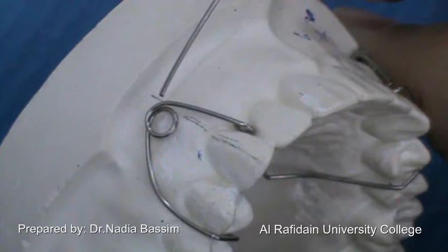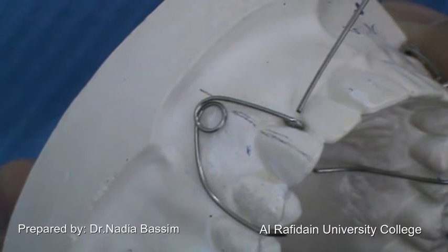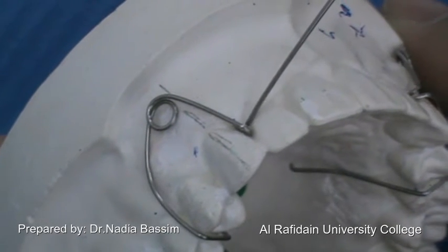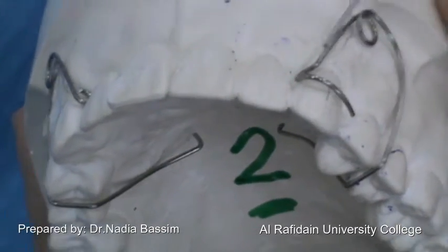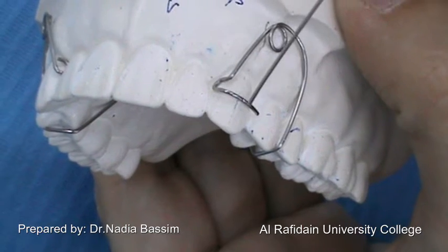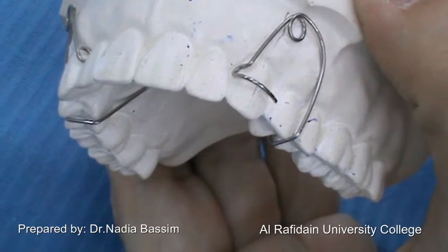We also have the mesial arc, which extends in a straight shape from the main coil into the interdental area. In the simple buccal canine retractor, it ends with a non-traumatic end in the interdental area, as cervical as possible to the tooth. While in the modified, it ends with a C-clasp — a U-shape that enters the interdental area — then a C-clasp in the middle of the crown, well adapted to the tooth surface to prevent food stagnation and trauma to the mucosa.